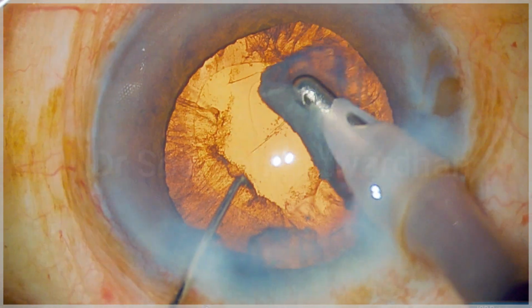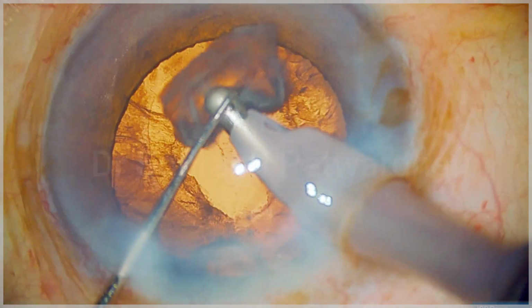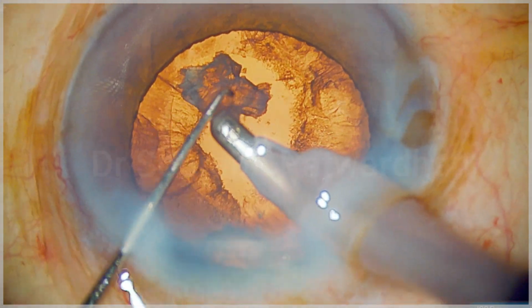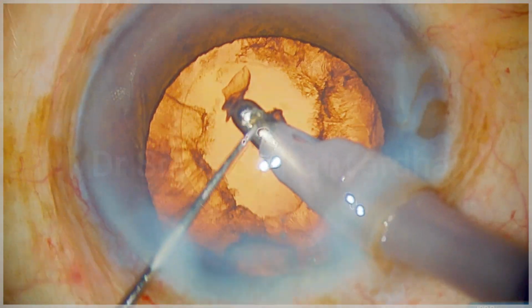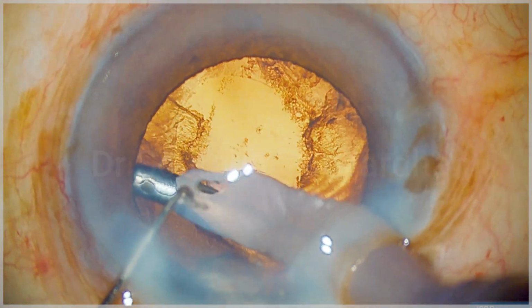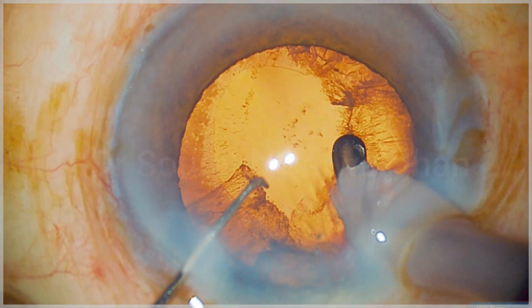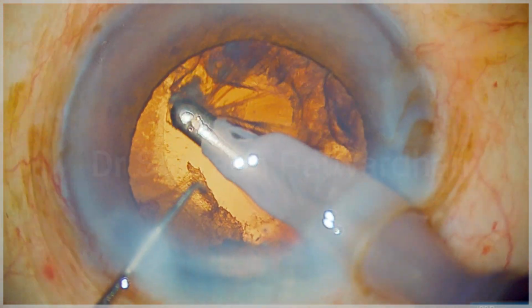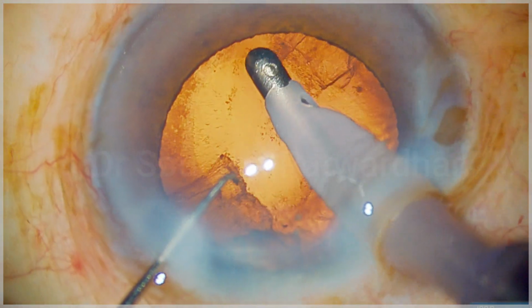There will be some opacities on the posterior capsule in these cases, but we must avoid the temptation to go near the posterior capsule, because though at present it looks quite intact, these are very fragile capsules, and even a minor touch on that will cause a posterior capsule opening. So just watch the OCT based classification again, and I have given the fourth type of PPC also, which is with the pre-existing dehiscence. I have shown this video on my YouTube channel previously also, with some cases where the posterior capsule was already dehiscent.